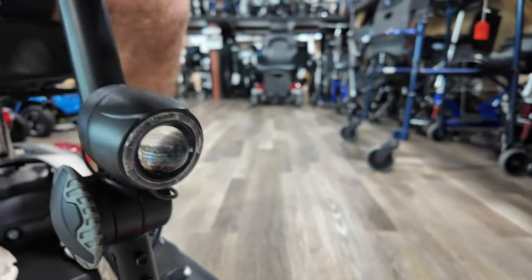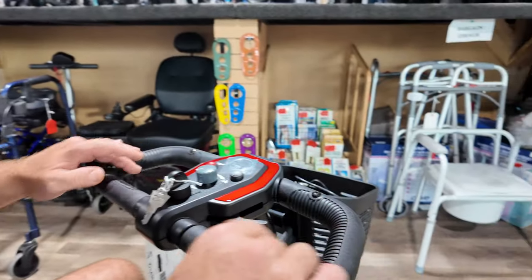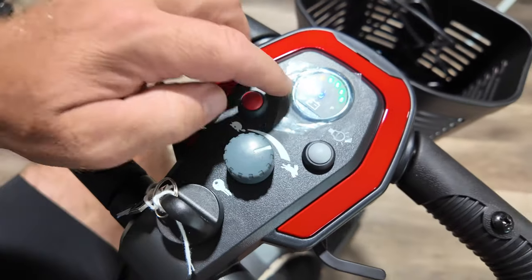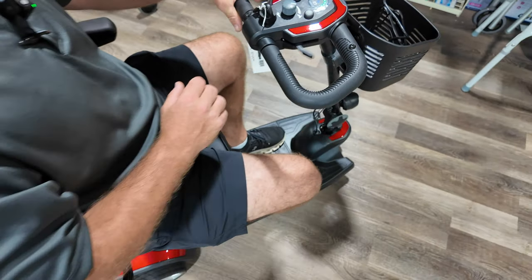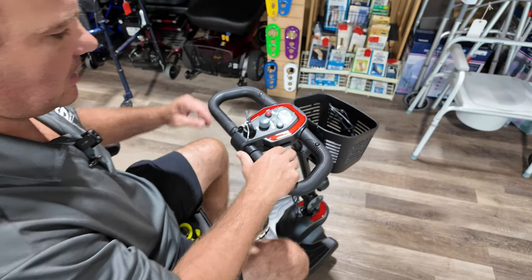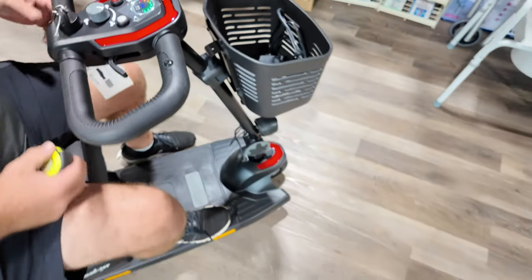You have a front light on this unit and a wraparound delta tiller. This is your horn, this is your light, this is your speed — pretty basic electronics up here. Forward, back, or you can use it with one hand if needed. Right here you could take these screws out and put a mirror on, and this also disassembles.